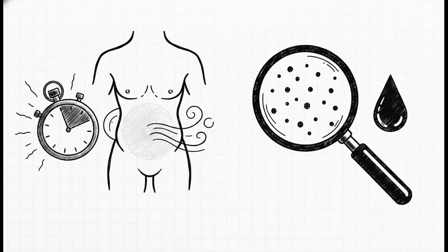On the flip side, you grab gradient echo when speed is paramount. Need a super fast breath hold scan of the abdomen? GRE is your best friend.